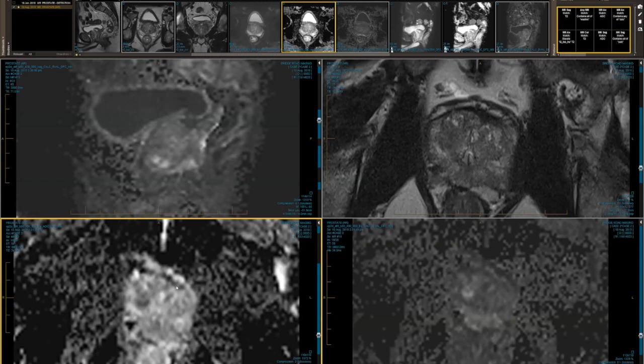As I said at the start, we've done prostate reporting for so long. We had instituted our own system prior to PIRADS, and we had drawings, we had lesion scoring well before the PIRADS committee met and went through into version 1 and then version 2.